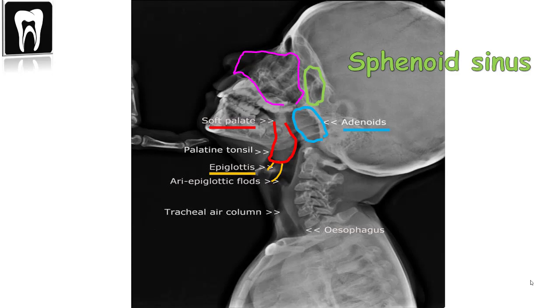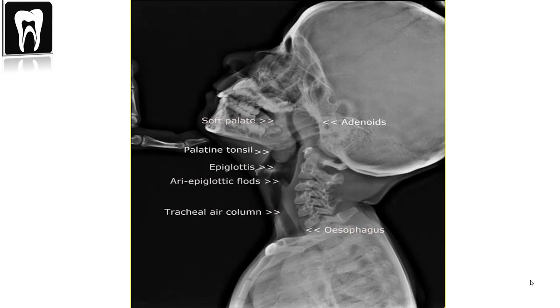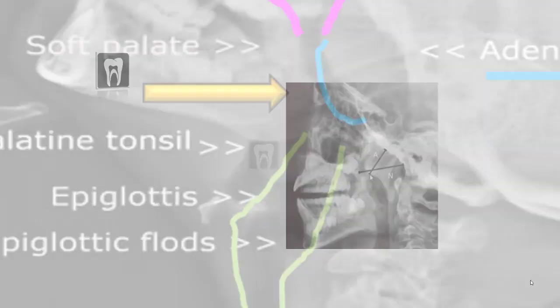The soft tissue coming down here is the soft palate, and this is the adenoid — we know it's in the roof of the nasopharynx. Starting from the nasal cavity, it looks normal as we can see the airway inside, then it gets constricted. The soft tissue projection causing this constriction is the adenoid, which could represent hypertrophy. In children, this is very important as it can impinge into the airway.